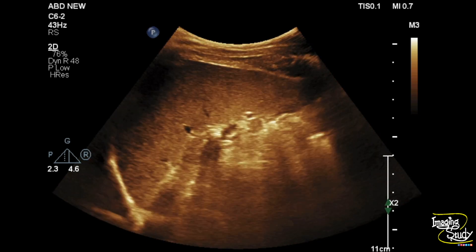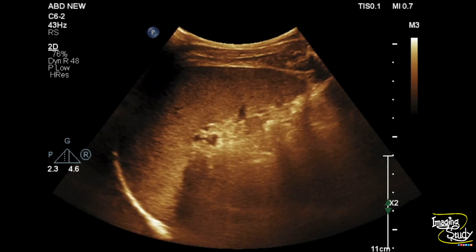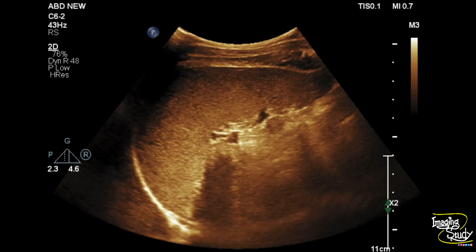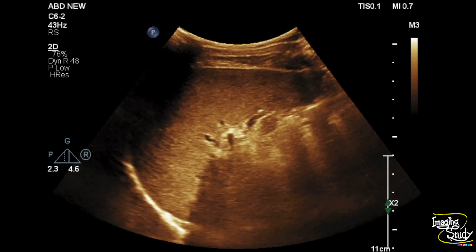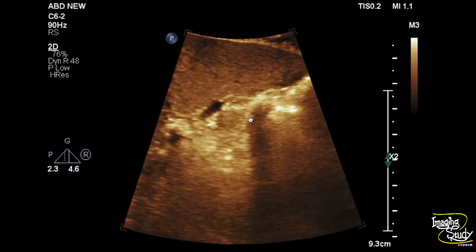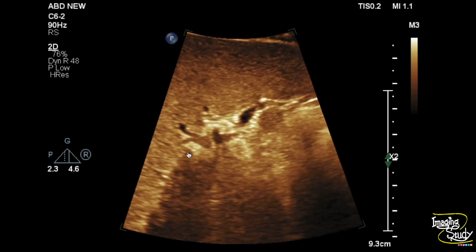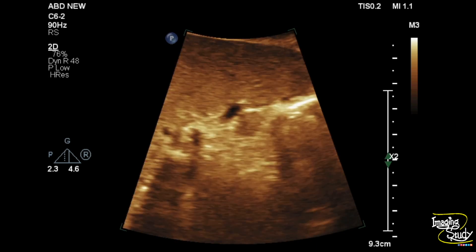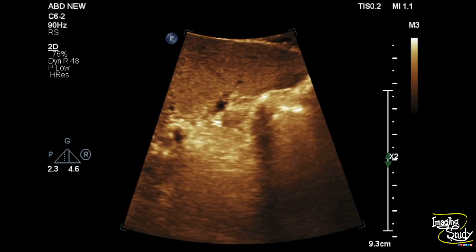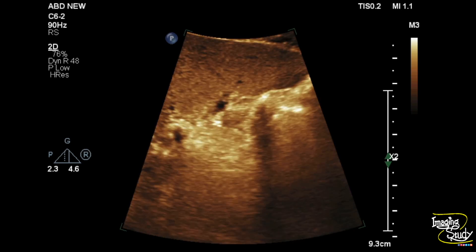This tiny structure is the accessory spleen or splenunculus. If you magnify the image, you can see the structure is capsulated and located adjacent to the splenic hilum.